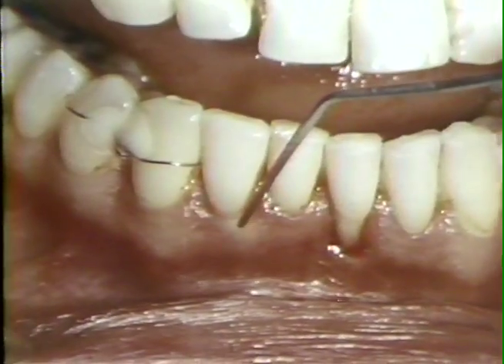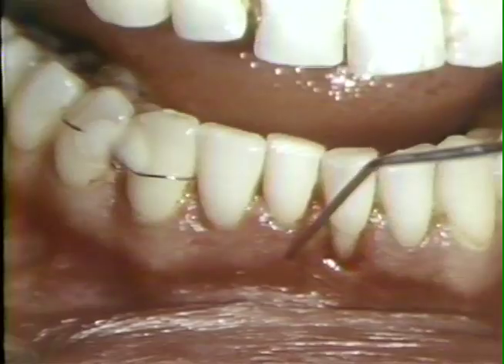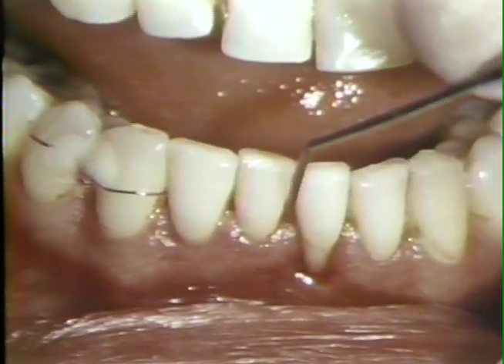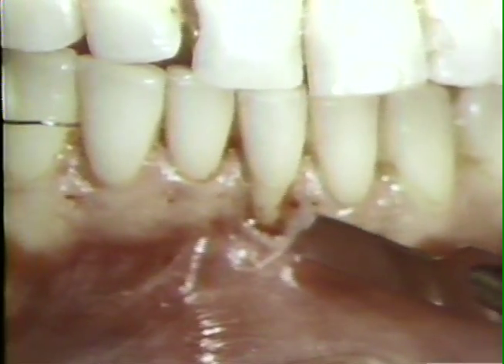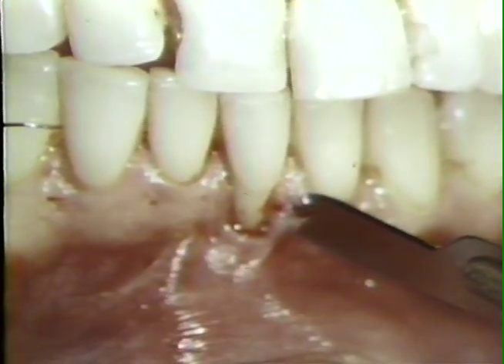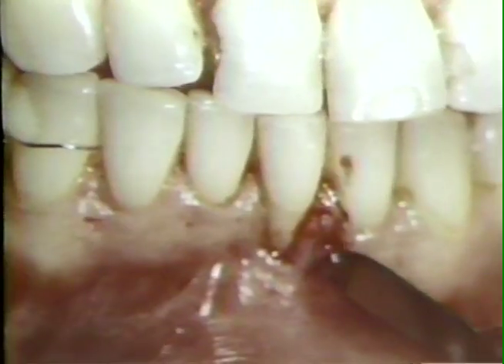The involved area has been initially prepared by scaling and root planing. The occlusion has been adjusted and the patient instructed in oral physiotherapy. After infiltration anesthesia has been obtained, vertical incisions are made with a scalpel to remove the inflammatory tissue on both sides of the cleft.